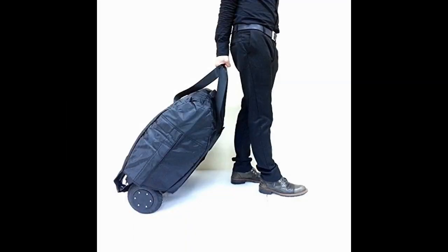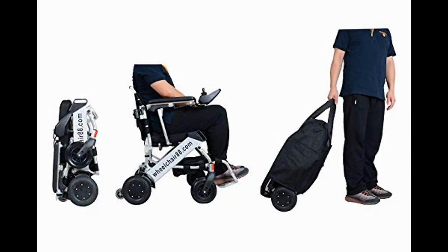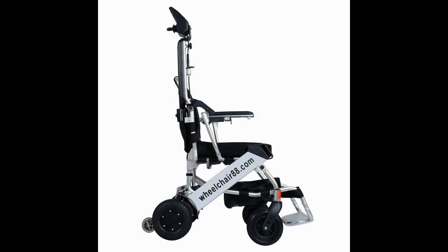We looked at other foldable chairs and scooters before stumbling across this. This chair is the lightest we have found by about 50 pounds, and folds up to fit in either the back seat of the car or the trunk. Unlike most portable scooters or chairs, it doesn't come apart into four pieces, so I don't have to worry about parts of it missing when traveling by air.